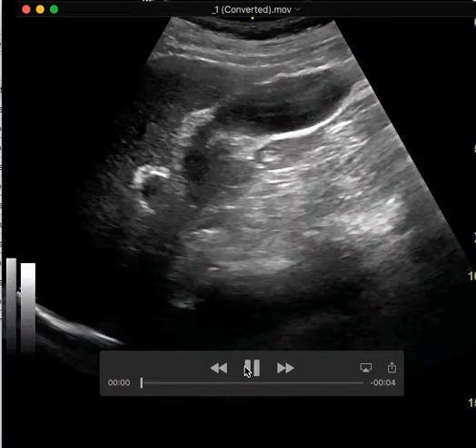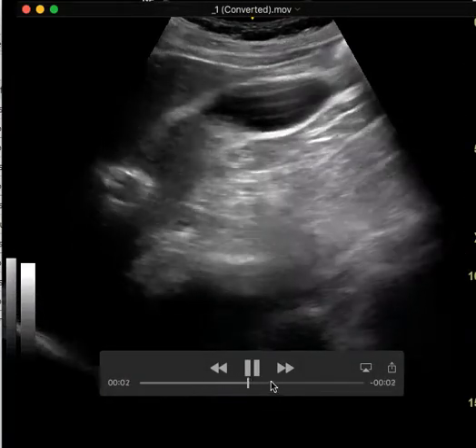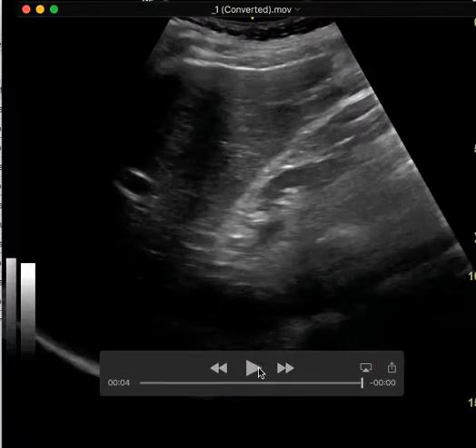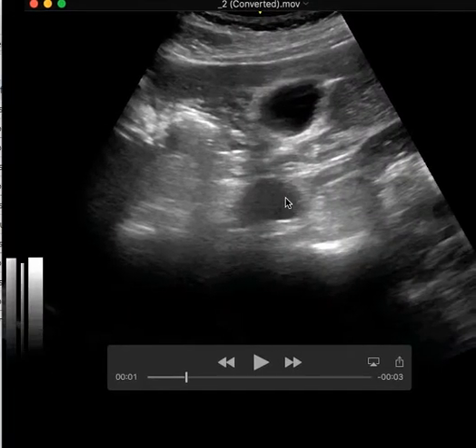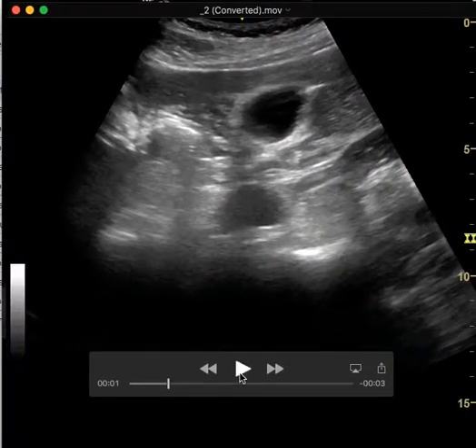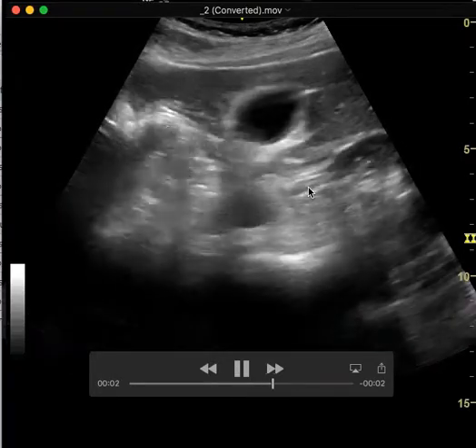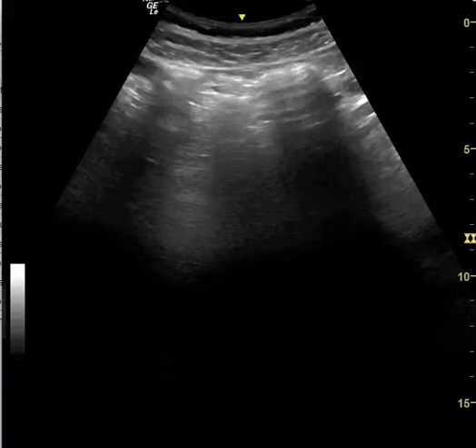This is a different patient, and this is the gallbladder in long axis. Then after the provider looks in long axis, they also image it in short axis. I'm able to see two planes of the gallbladder, which helps me really differentiate if there are stones or not.